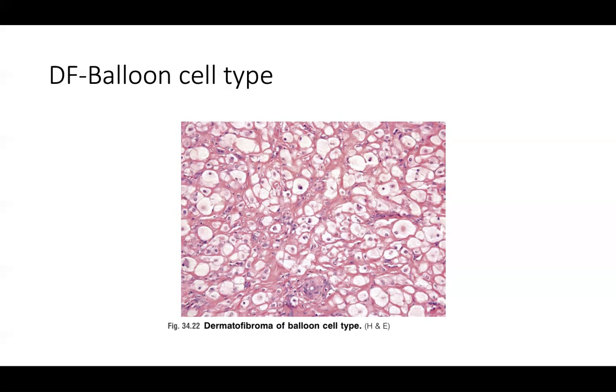You can do a factor 13A, but a lot of times this is going to come down to ruling out all the other stuff and the overall histopathologic picture and factor 13A positivity, et cetera. CD34 should be negative in this neoplasm.